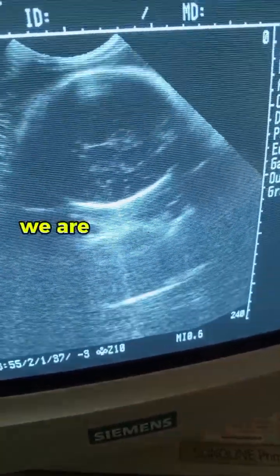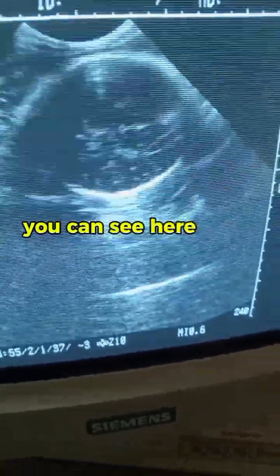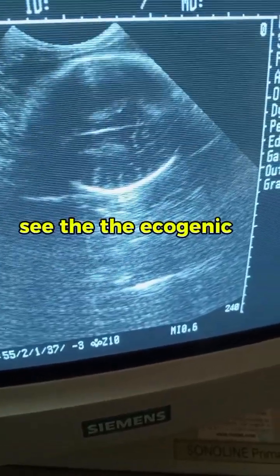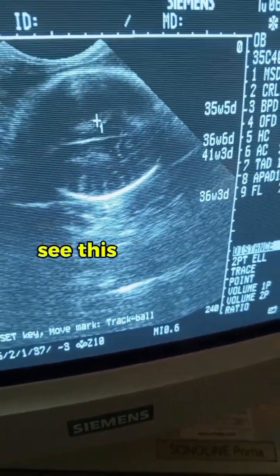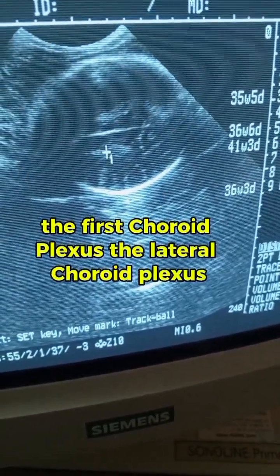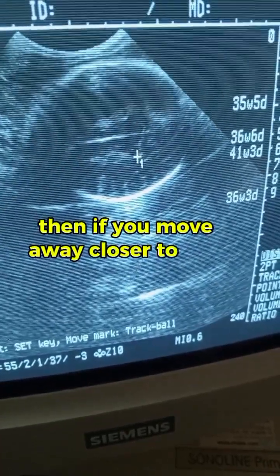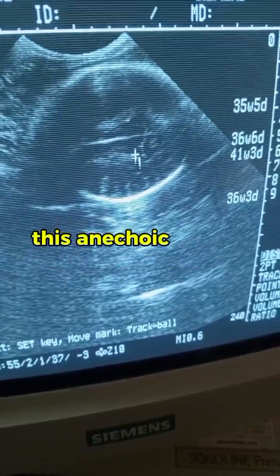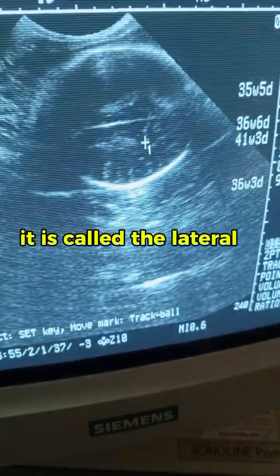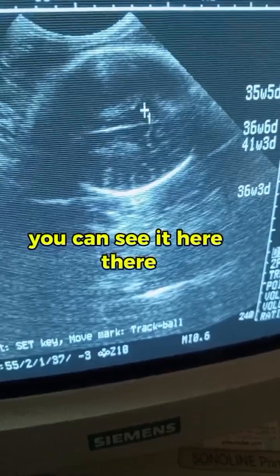Now we are going to look into the anatomical structures of this fetal baby. Let's look at the choroid plexus. See the echogenic area here that you are seeing. This is the lateral choroid plexus. That shows that the baby is very, very okay. Then if you move closer to this choroid plexus, this anechoic area here, where I'm pointing this caliper, is called the lateral ventricle. You can see it here, there, over there as well.